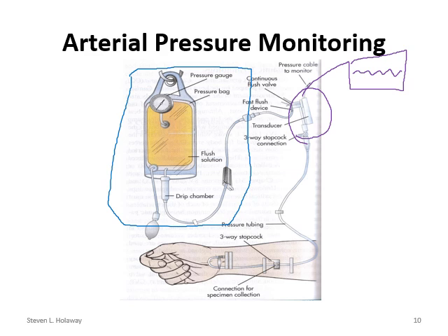This has to be pumped up. This is a pressure bag, and it needs to be pumped up to 300 millimeters of mercury. I don't write real well with the mouse, but anyway, 300 millimeters, okay? This basically keeps this flowing freely. If we didn't have this pressurized bag, we would get blood coming back out of the site, coming back up the tubing. So we want to make sure that we're keeping that pressurized.